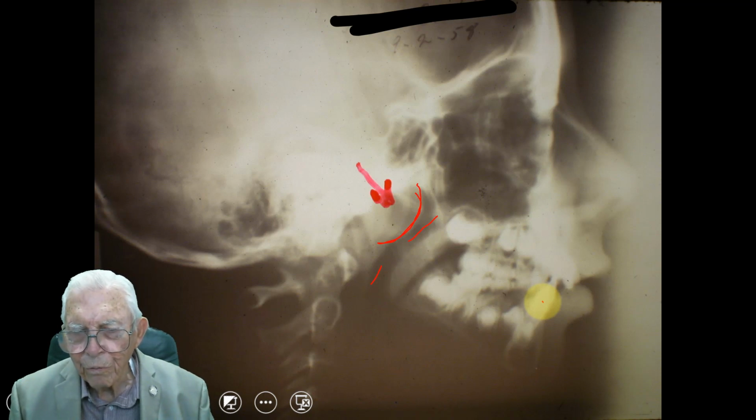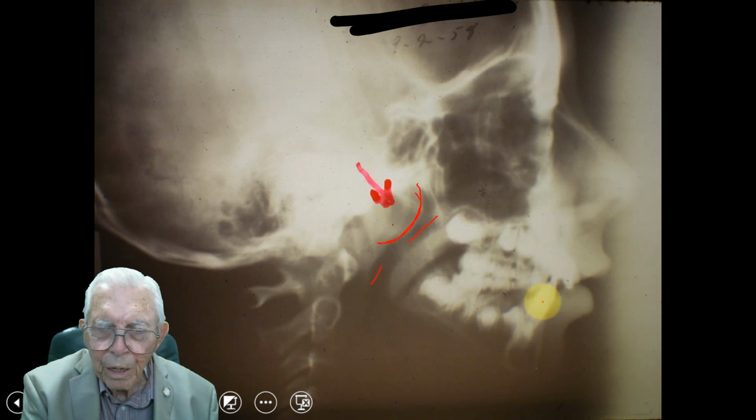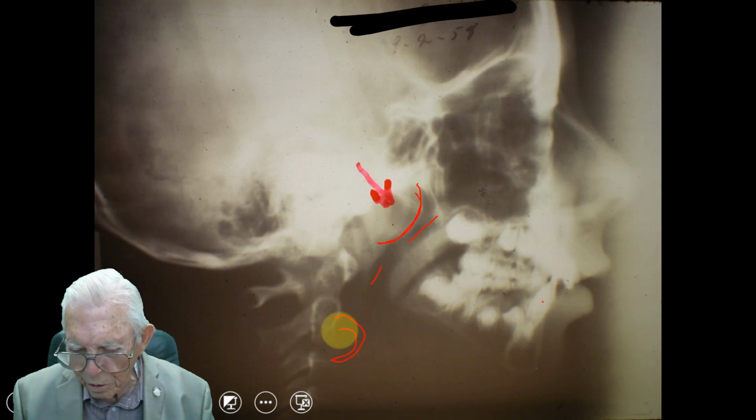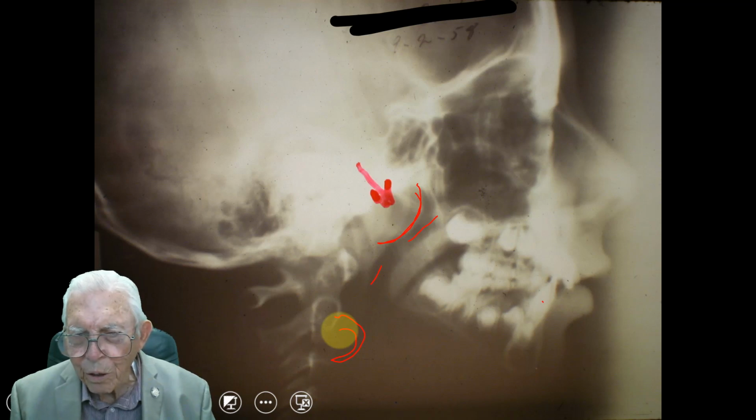from doing that. Now, the tonsils, you can actually have them lower their tongue down, and you can see the tonsils down in here on a lot of these cases where you have tonsils swelling up, they get irritated and kind of pus-like looking. So here we've got enough problem with the adenoid tissue.